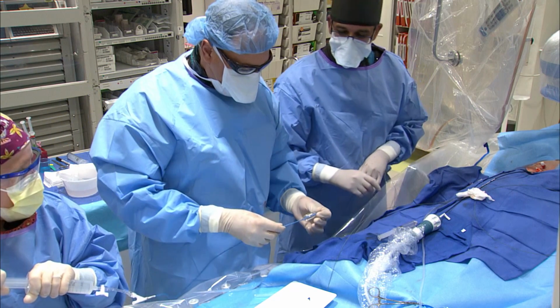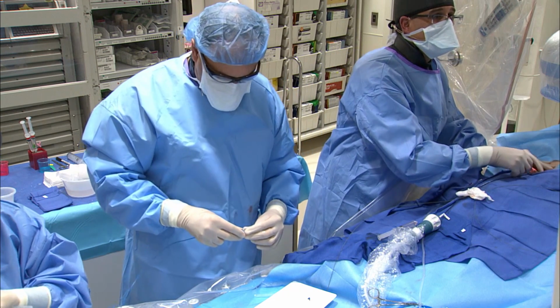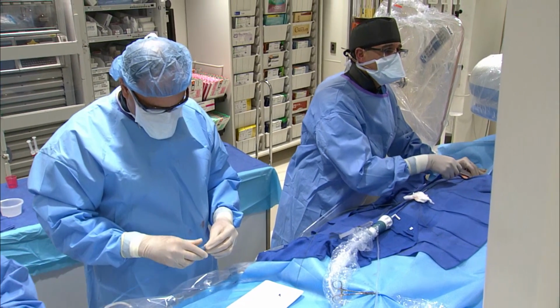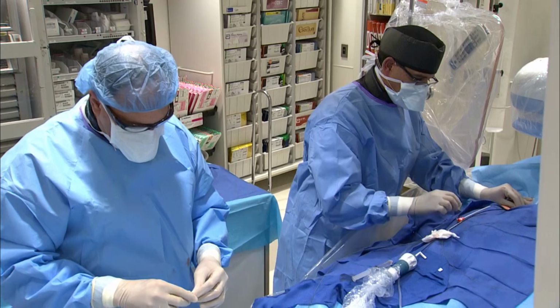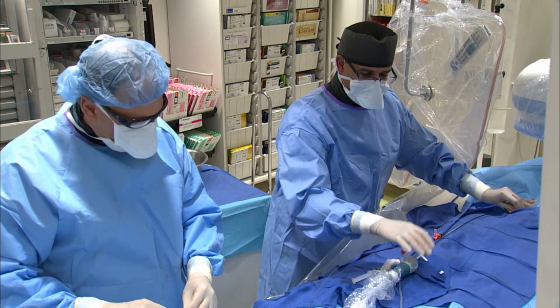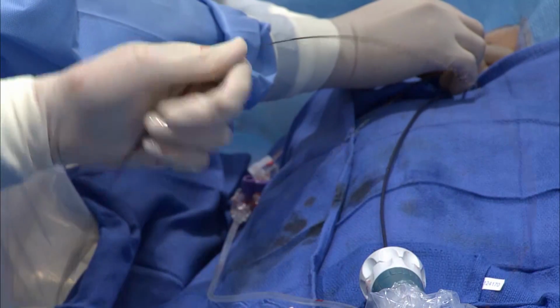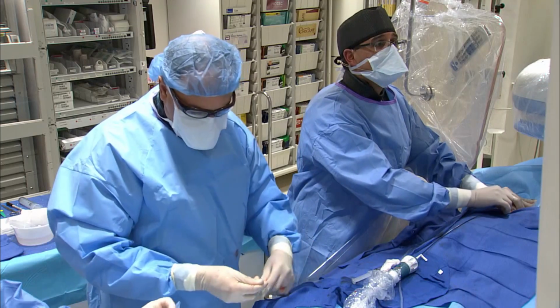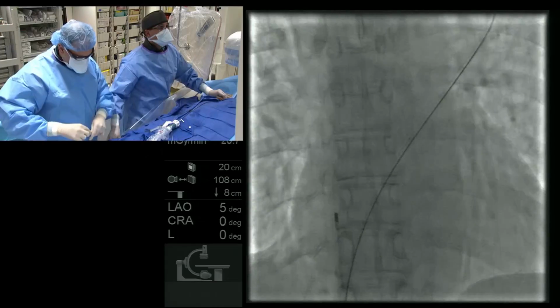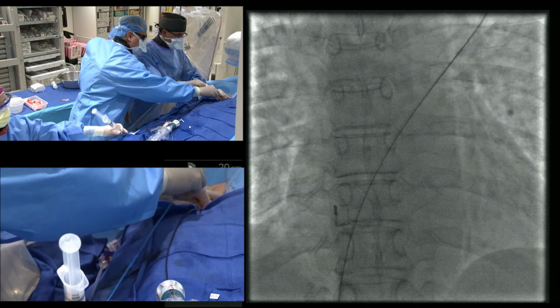Okay, I'm satisfied with this. Okay, Andreas, let's get the sheath out. Because there is no blockage, there is not much resistance in getting this balloon up, so we should be fine. Just take that sheath off. So we're going to use ICE as well as fluoro both.